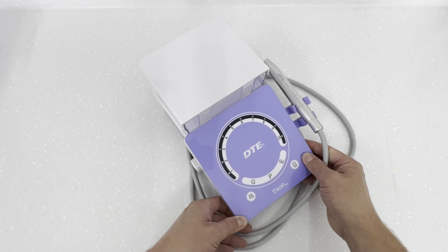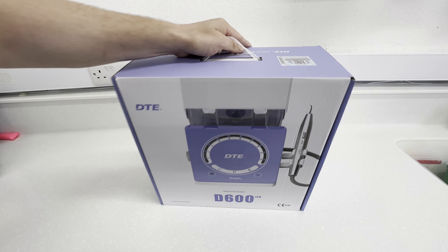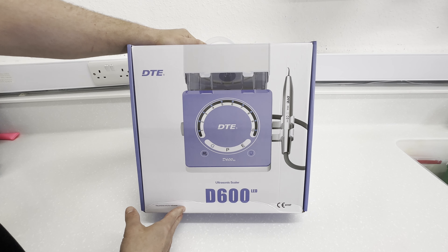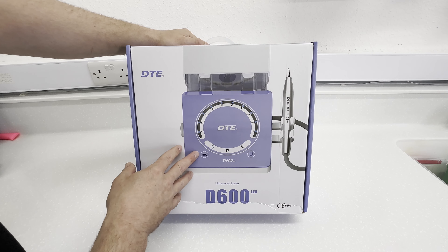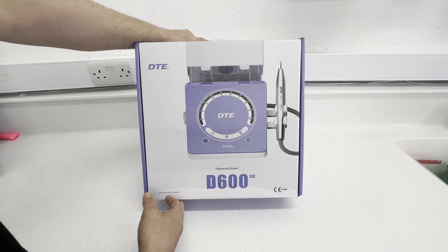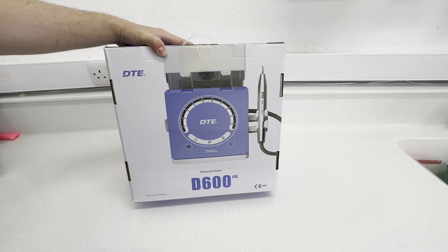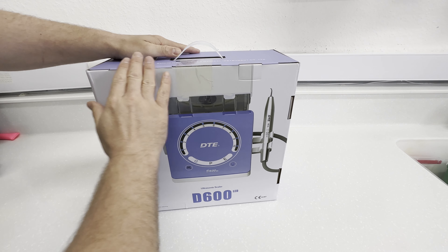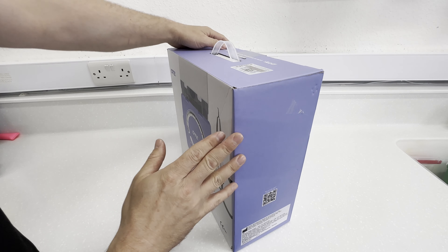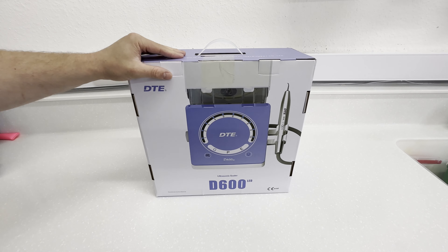This is a blind opening of the D600 ultrasonic scaler by Woodpecker or DTE. My first impression — this is quite a substantial box. When I was told I was getting sent this I wasn't expecting such a large box, and you'll also notice the box itself has a nice bit of quality to it.